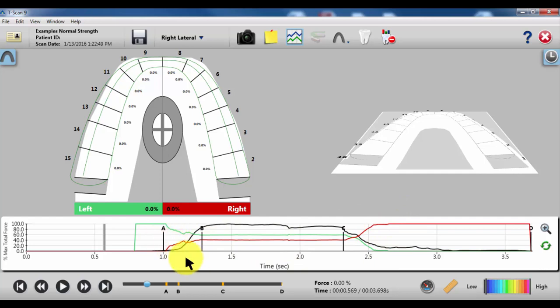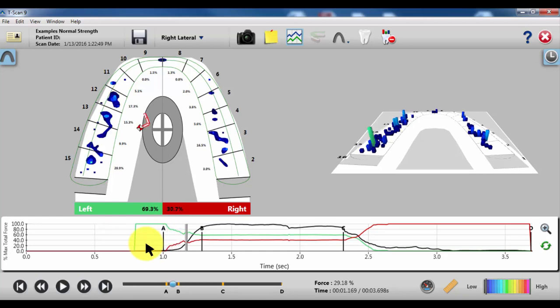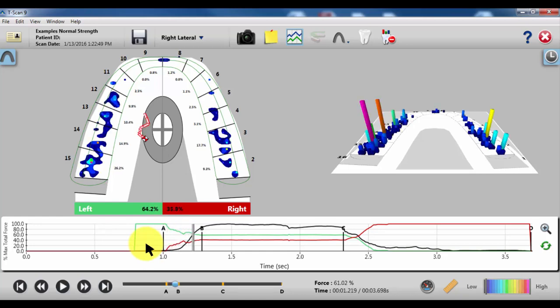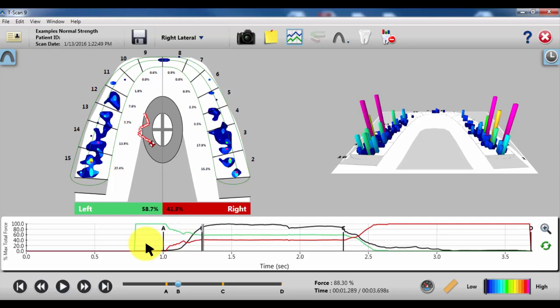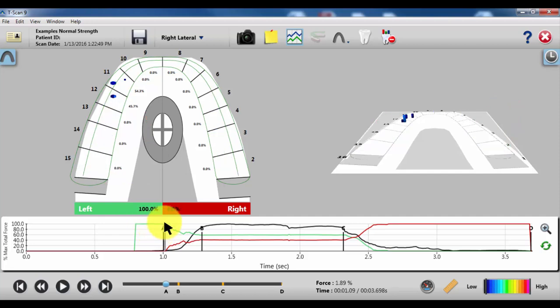Once you've done your multibite and picked your best bite, you want to start evaluating at the A. You want to get a good clear picture of what the center of force pattern is doing. In this version, we're getting this kind of zigzag movement, but it's centralized on the left side.